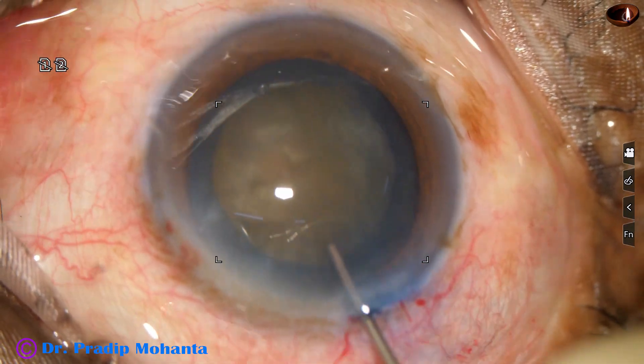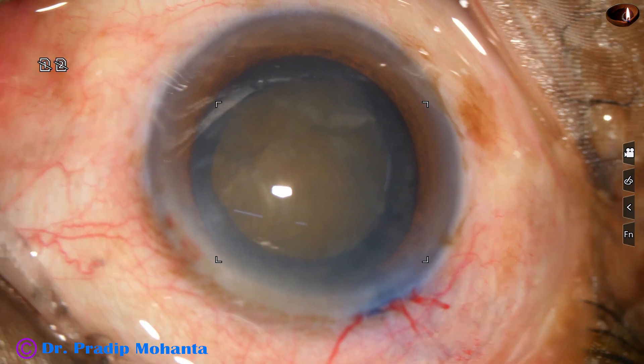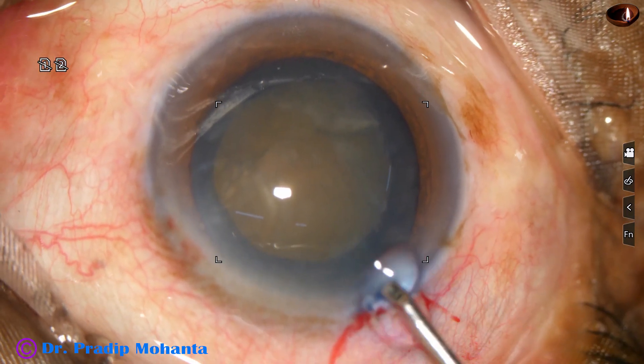Hydroxypropylmethylcellulose hydrodissection is done. And now nucleus management by my technique, which I call submarine chop.